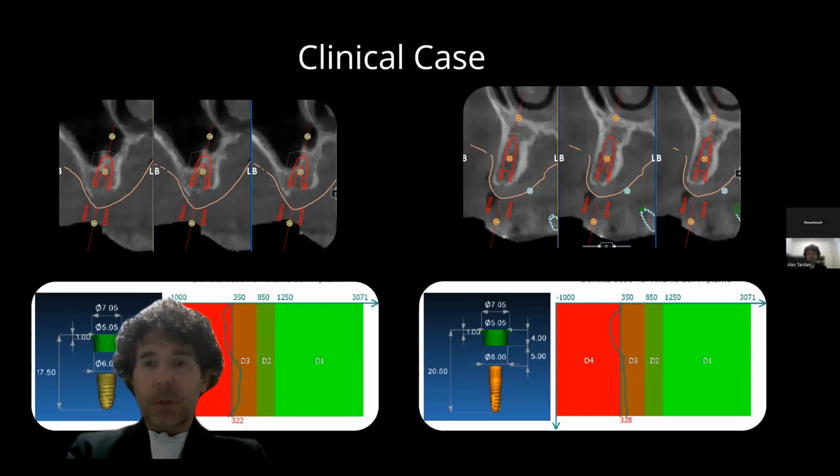On the other hand, at the site I mentioned before, for the implant in position, we are certainly facing an area where the coronoapical distance is more than acceptable, but a certainly limited buccolingual distance. Here I'm placing an implant, a 3.3 I believe, so a very narrow implant.